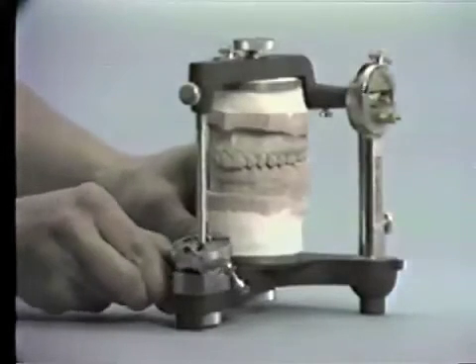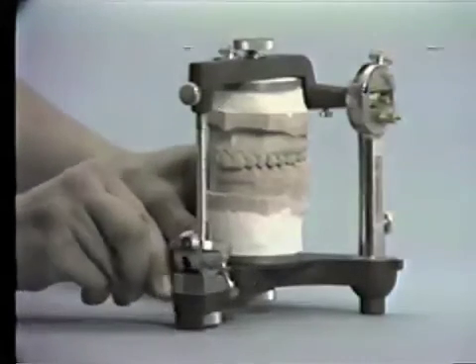If the incisal pin is not centered anterior-posteriorly, a change in the vertical dimension will occur if the incisal table is moved from the zero setting.